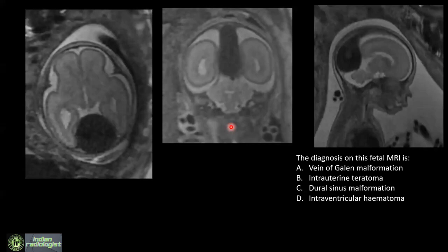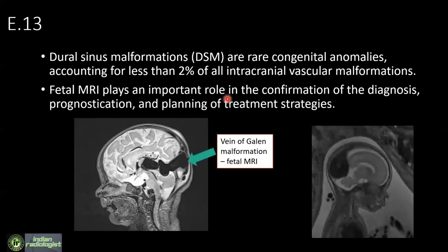This is a fetal MRI case. Most replied vein of Galen malformation, then dural sinus malformation. There is a large abnormal flow void representing a vascular channel, but the location is not that of a vein of Galen malformation. This is a dural sinus malformation which has been partially thrombosed. These are known to resolve — if followed on fetal MRI or ultrasound, they will slowly reduce in size. On ultrasound they may be mistaken for posterior fossa masses.